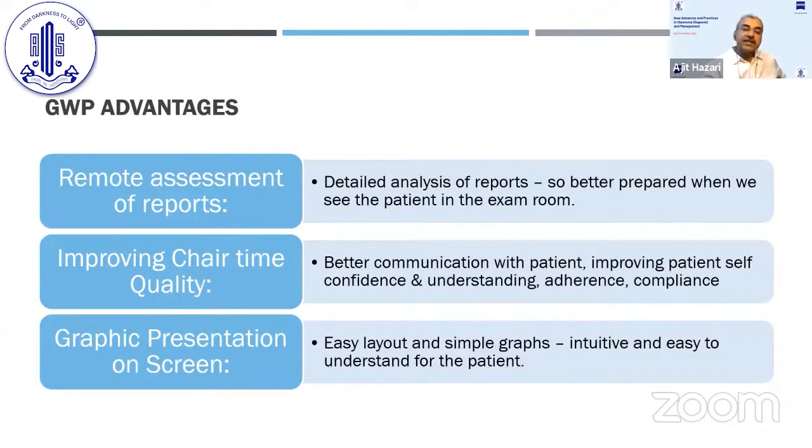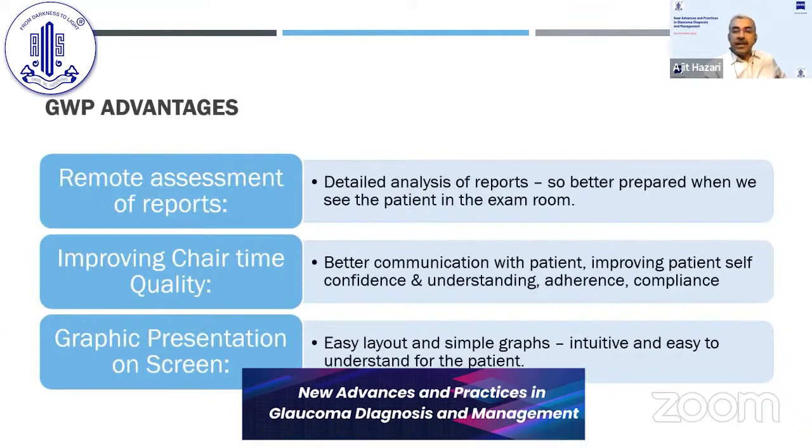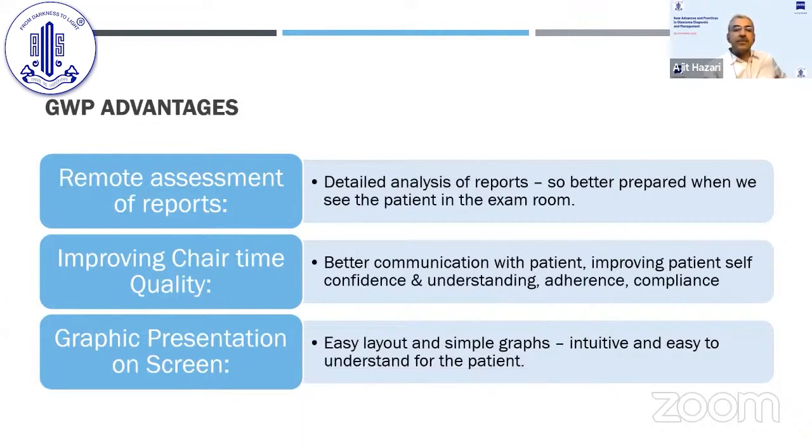I can sit in my chamber, look at all the reports at a remote terminal, and go through it in all details. So I'm completely armed with all the data for the patient. And when I go into the examination room to sit in front of the patient, I can quickly explain everything to them. So detailed analysis of the reports is available remotely, and we are better prepared when we see the patient in the exam room.